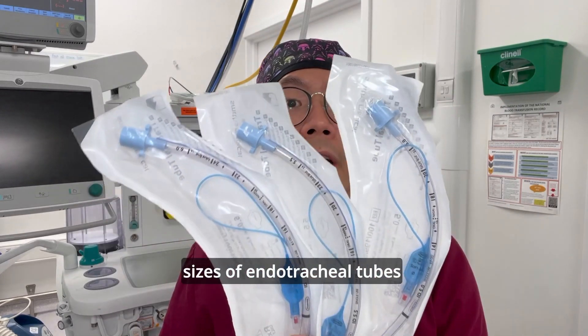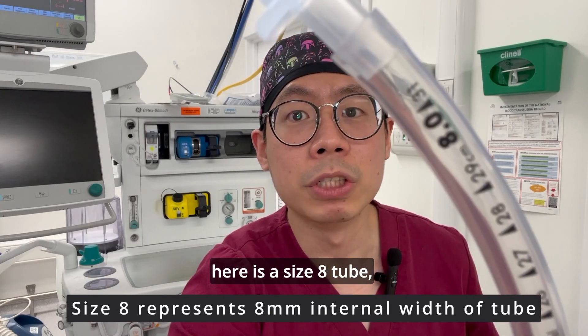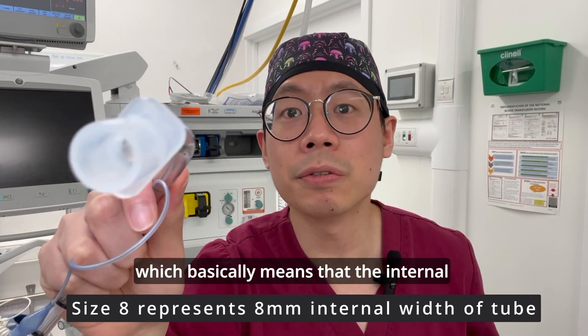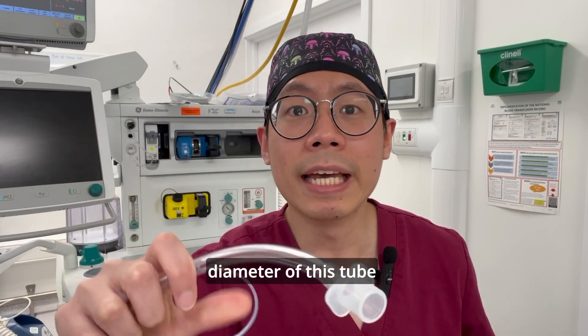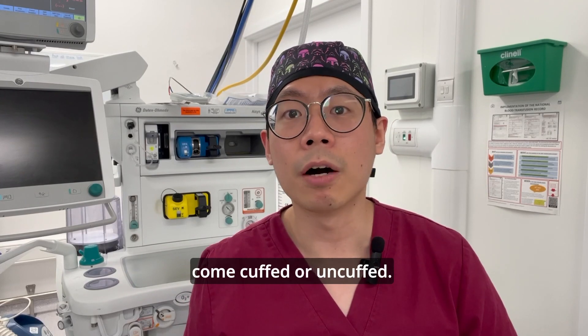There are different sizes of endotracheal tubes, and the one I have here is a size 8 tube, which basically means that the internal diameter of this tube is 8 millimeters wide. ET tubes can come cuffed or uncuffed.